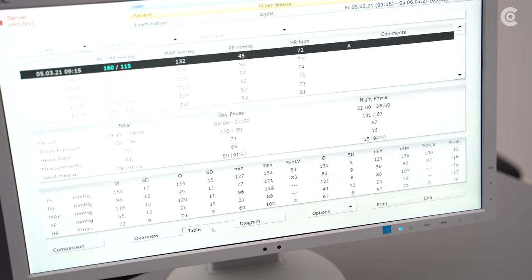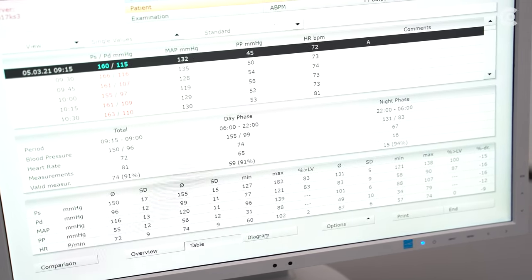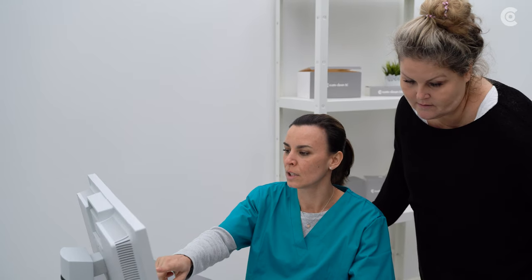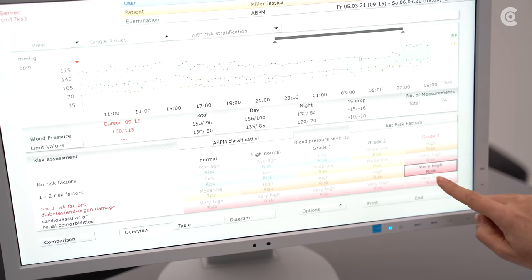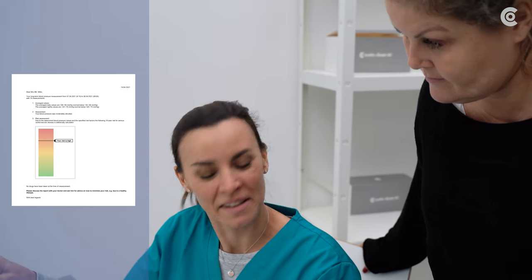Different views of brachial blood pressure are available. Beside the presentation in an overview, there is a table and a diagram view. You can additionally call up the blood pressure development and use it as a communication aid for the patient. Furthermore, you can print a report and give it to the patient.